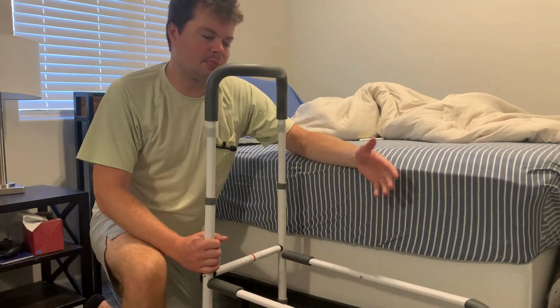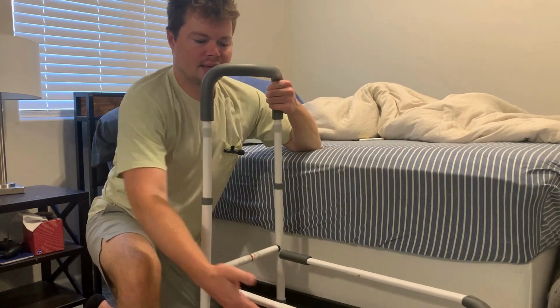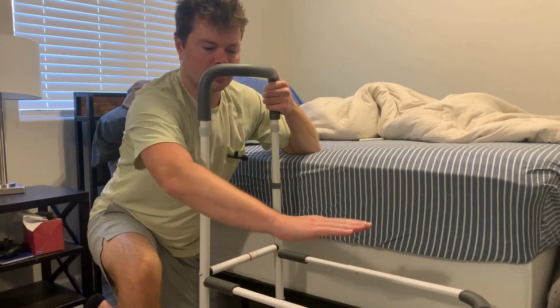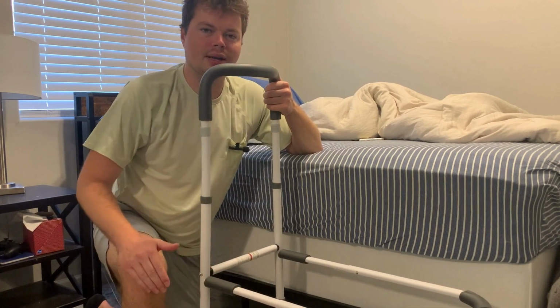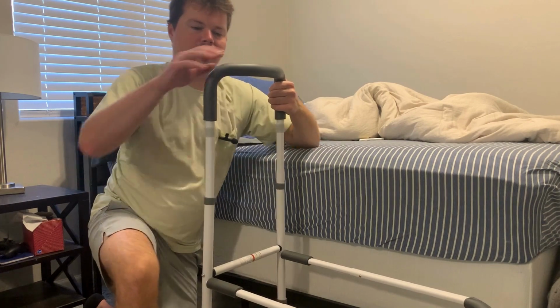Just make sure you have some type of bed frame under there that maybe is like a platform bed frame or something where this can have some support underneath it so it can sit between the mattress on top and support underneath, and that way it's going to stay secure for you and not move around. But let's get this onto my bed now.